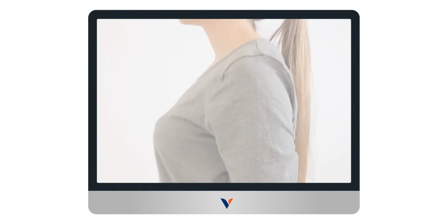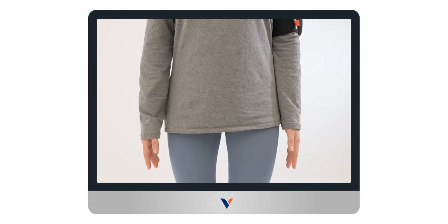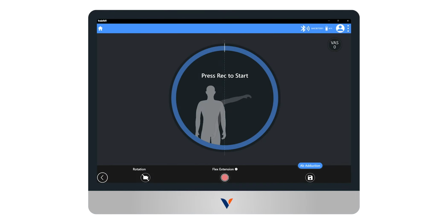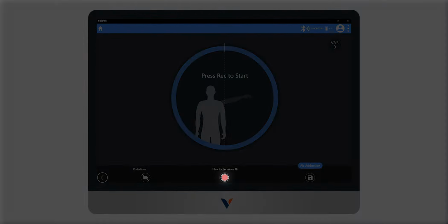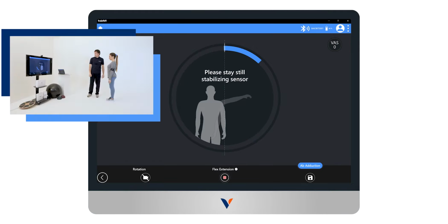The subject again starts the test in an orthostatic position with the arm along the side in an anatomical position. First, check the correct position of the sensor and adjust it if necessary. Once the patient is ready, start the acquisition by clicking on Rec. Again, wait until the stabilization ring disappears before starting the test.